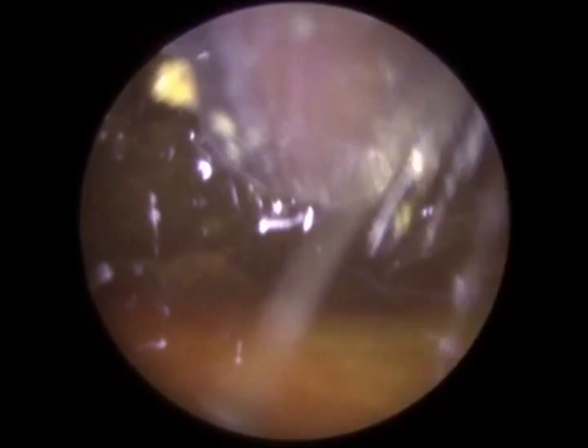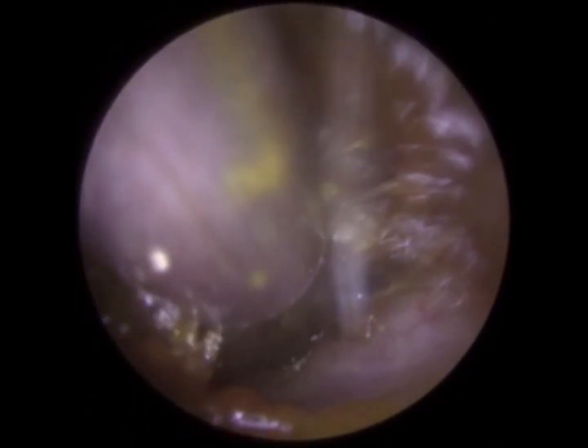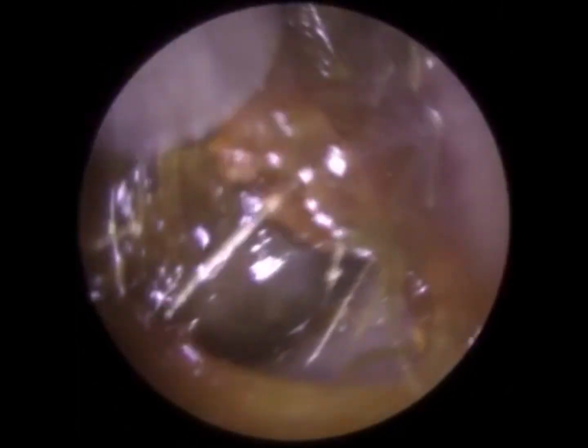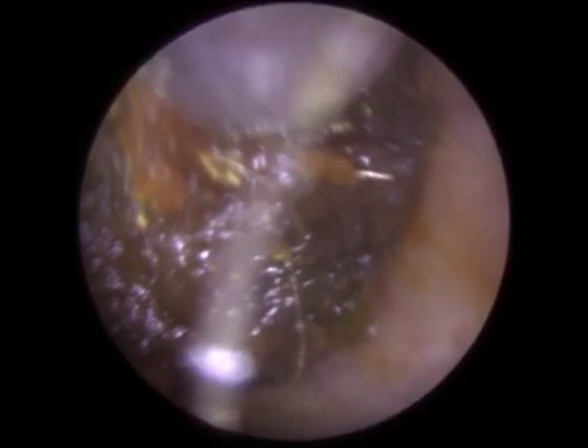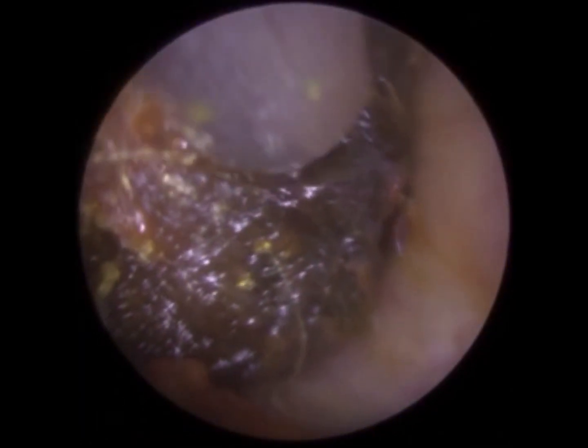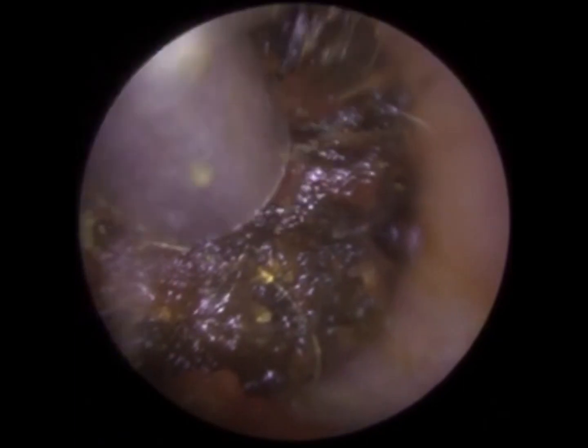We soaked the ear for roughly three or four minutes. The left ear was facing the ceiling — we completely soaked it with ear roll olive oil spray — and then for a couple of minutes we got the patient to tilt his head the opposite direction, which then allows some of the olive oil drops to drain out. Here we're just using the Zolnir suction probe to help elevate the wax and dead keratin off the canal wall, going around the edge. Despite using the olive oil drops, it still was very glutinous, at least the wax that was more lateral near the entrance. If it's a bit blurry now and again, it's just the olive oil — there is still some residual oil in the ear, and that kind of blows the screen as you vacuum some of it.